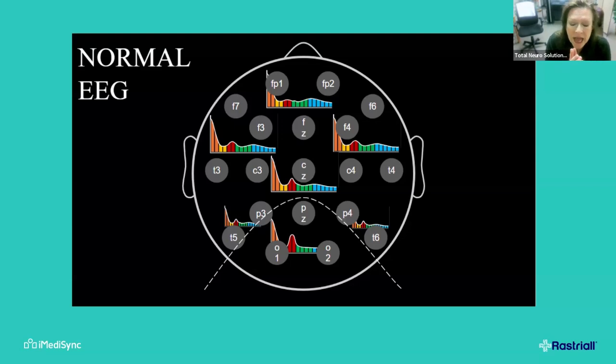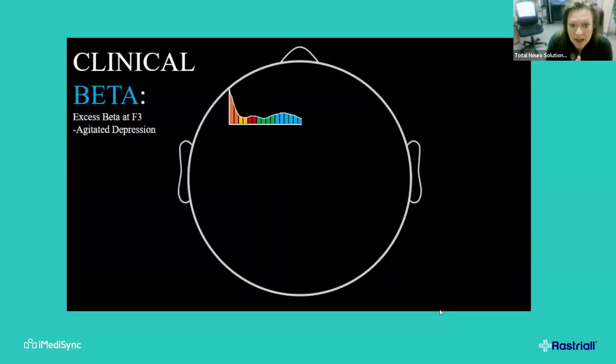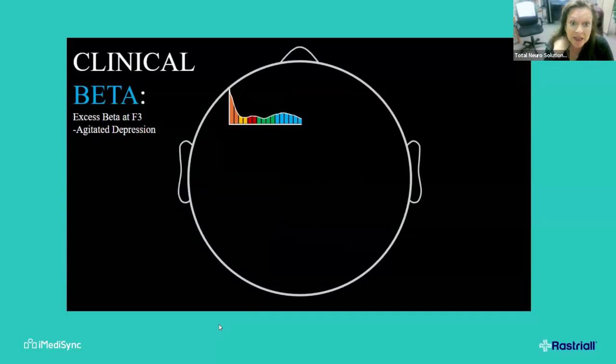Also, because 85% of the information coming to our brain comes through our visual system, if we're a sighted person, when we close our eyes a lot of that goes away, and on-task betas should calm down and slow waves should kind of take over, because we're going to an internal focus into a calm state. That's one way the anterior-posterior gradient can help us know if things are in line or not in line with what we expect.